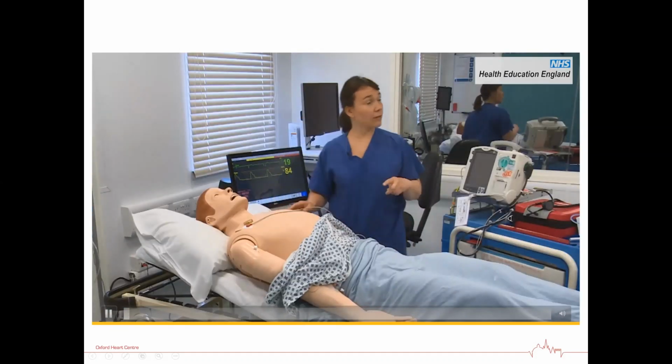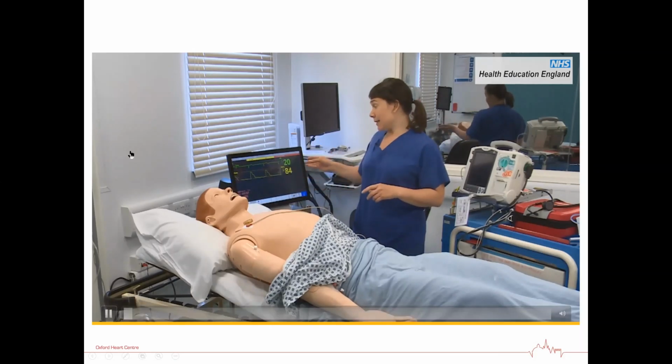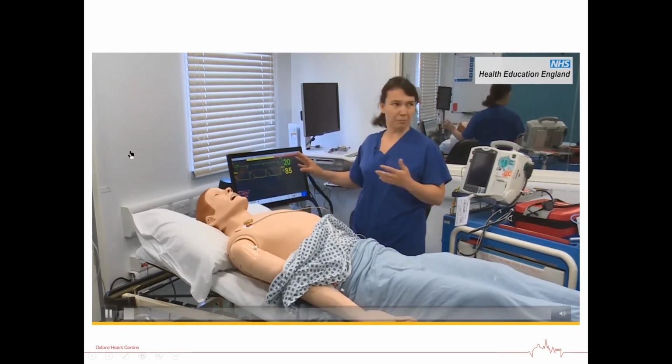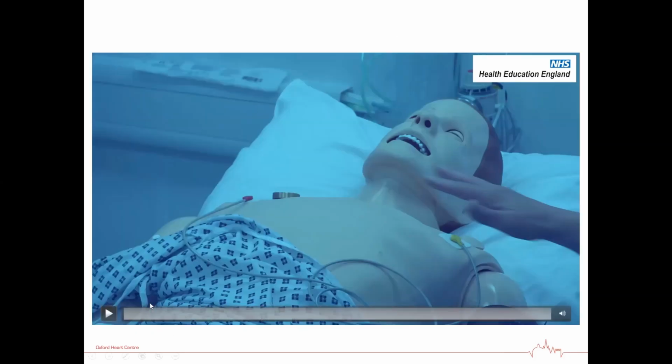Hi, I've got this patient, Mike Walker. I've just put him onto the monitor. His pulse rate's very, very low, looking a bit like block. Can I just check you can all hear the audio okay? Yes, the audio is great on the video. Perfect.